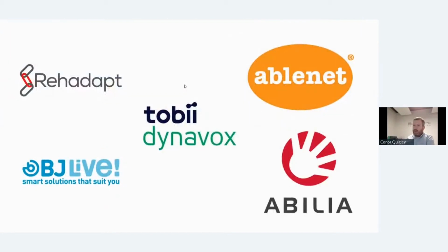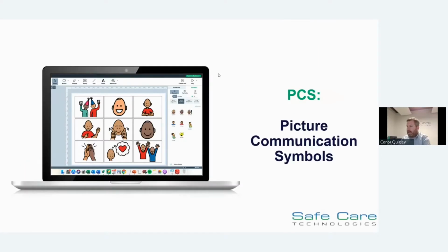So we supply from a range of different companies. The company we're focusing on mainly today is Tobii Dynavox, as they are the developers of both Boardmaker and TD Snap. So they're the company we'll be focusing on mainly.